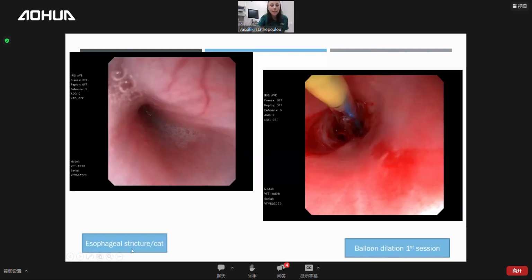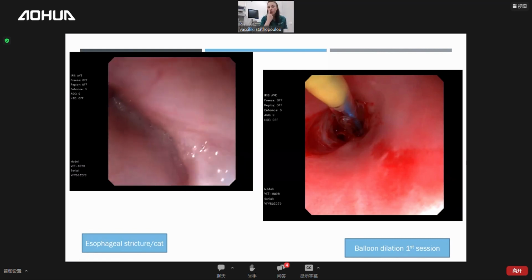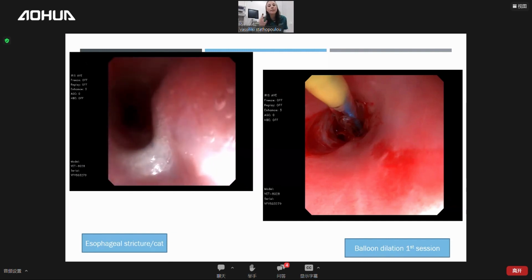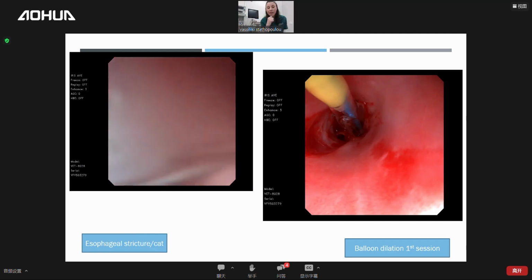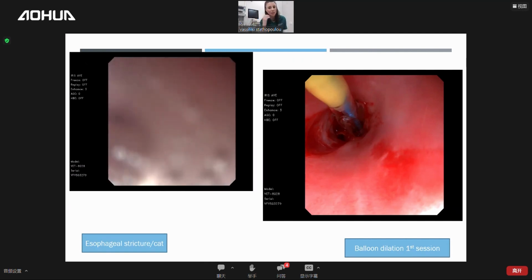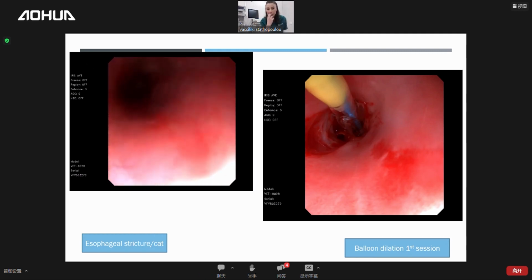Okay, let's see the esophageal stricture in a cat. This is the cat that I've shown you earlier. We reach a point where the esophageal lumen has no width at all, and you either have to do this or it's esophageal surgery, which is not good. Esophageal surgery actually causes more stricturing afterwards. Most of the time we succeed with the balloons.